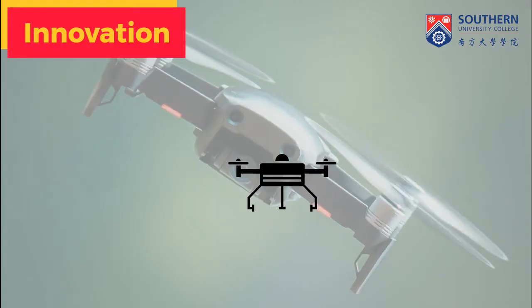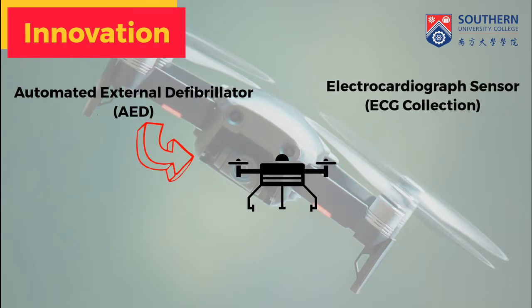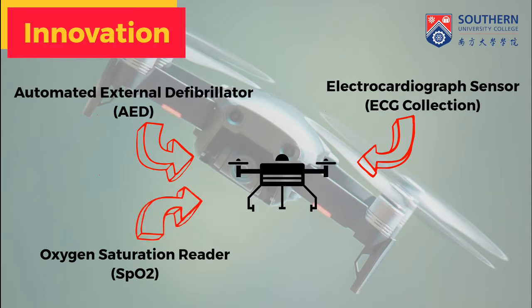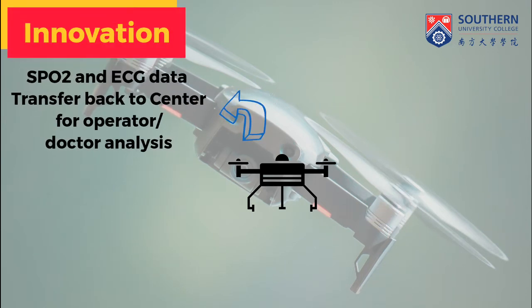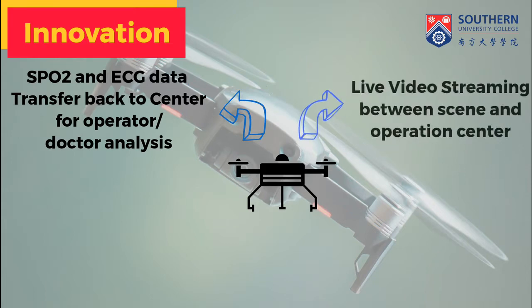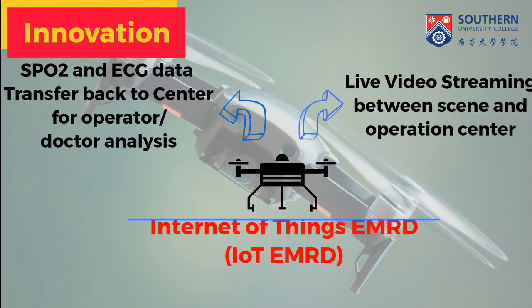The EMRD is built and integrated with several critical medical equipment, including an automated external defibrillator, ECG collection module, oxygen saturation reader module, and oxygen supply module. The collected data will be sent to the Command Center for Medical Officer analysis, meanwhile giving instructions to the helper through live stream video.